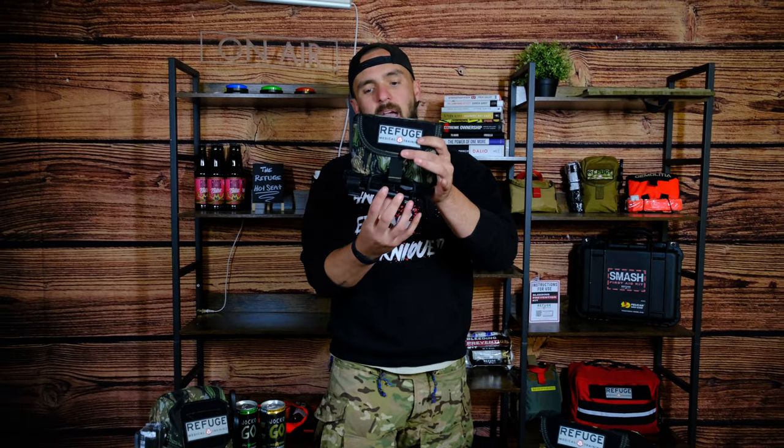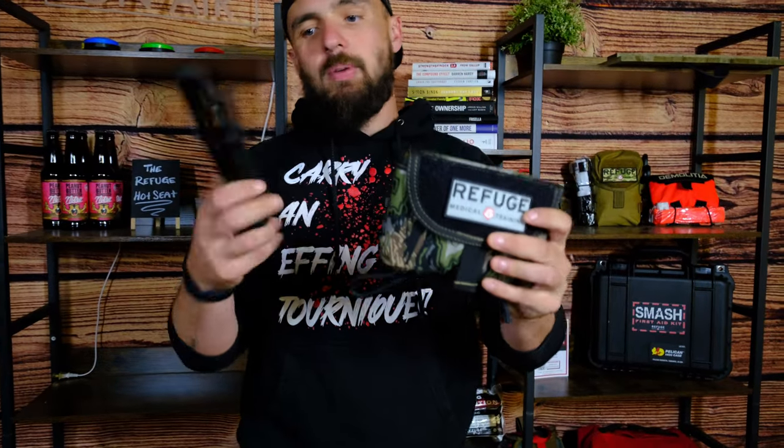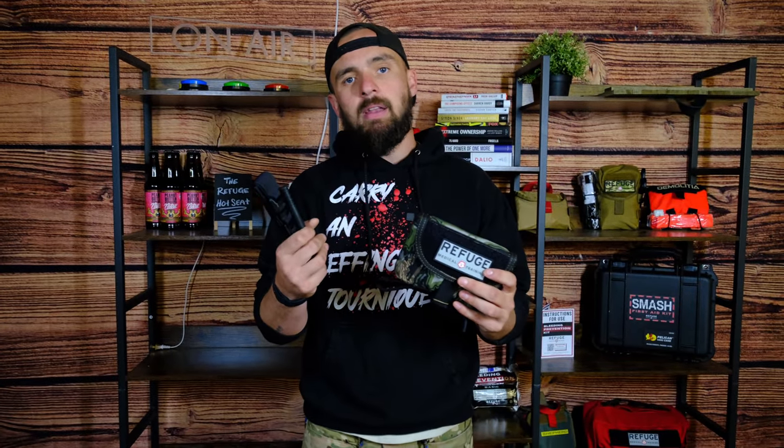On the outside we have a combat application CAT Gen 7 tourniquet from North American Rescue that is easily and rapidly deployable, so that way if you were to have an accident while you're out on a hunt, you have one of these tools right here that can stop a massive bleed in the extremities.